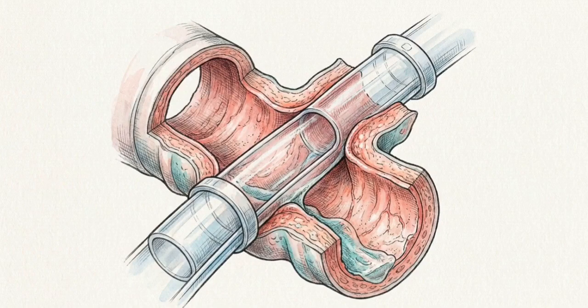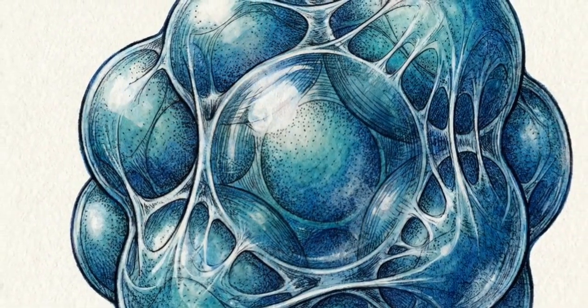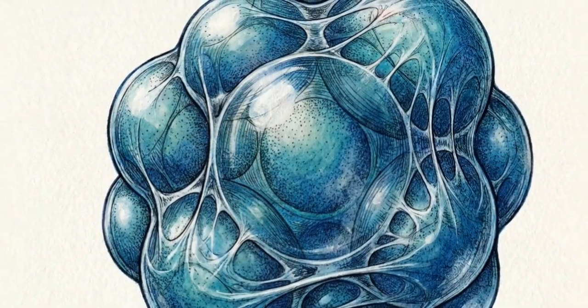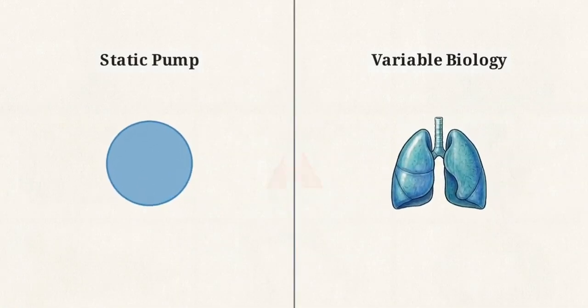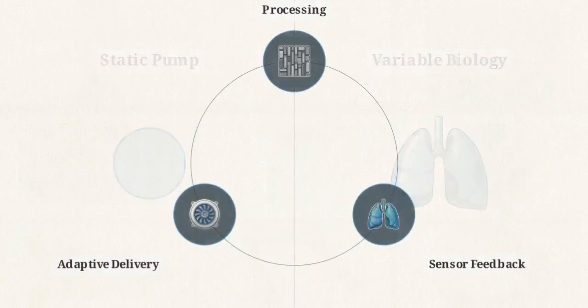Forcing pressurized gas into human lungs creates an immediate physical conflict. In mechanical ventilation, you are balancing raw pneumatic force against the highly fragile, variable compliance of biological tissue. A critical care ventilator cannot be treated as a simple mechanical bellows. Human lungs respond to pressure differently breath by breath, requiring a device that adapts instantly to avoid causing catastrophic trauma.